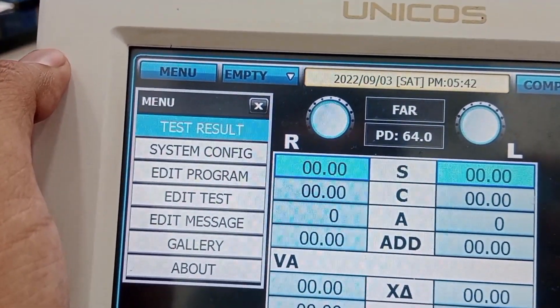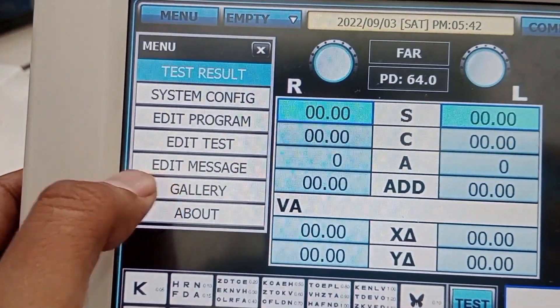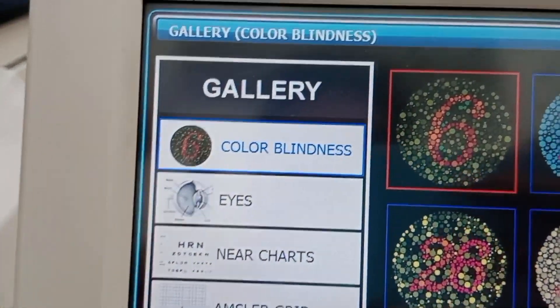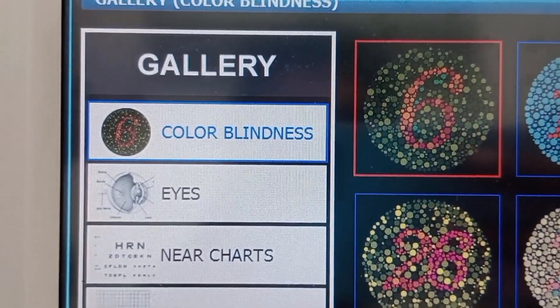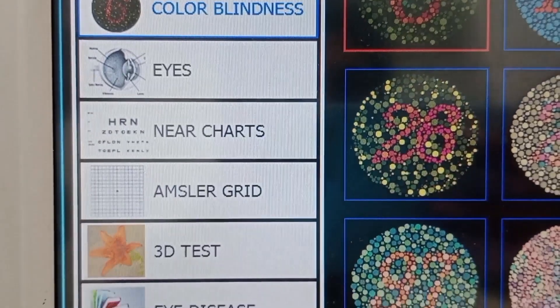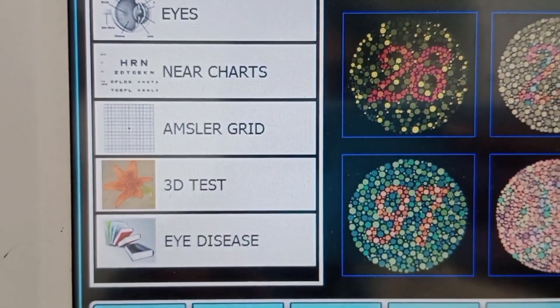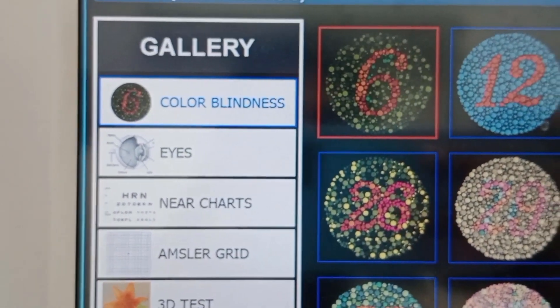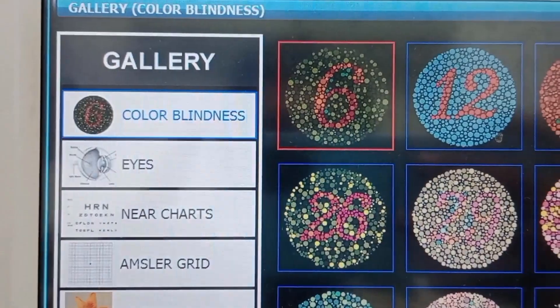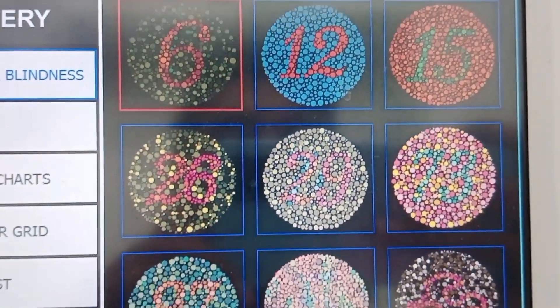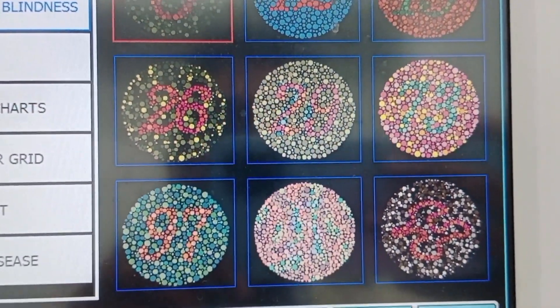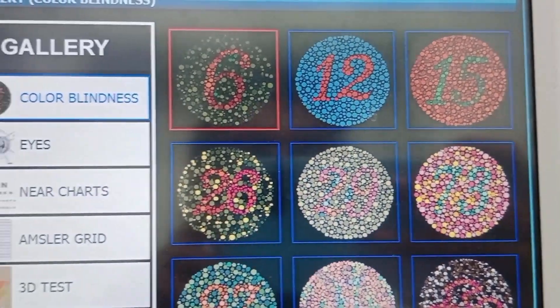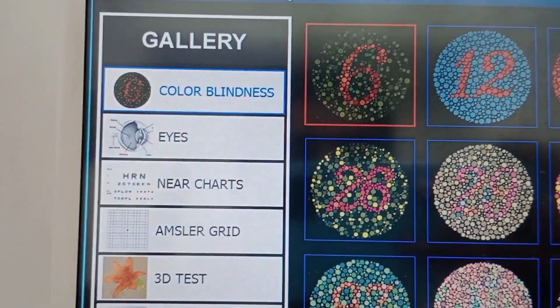The next menu setting is gallery. In the gallery, we have a color blindness test. You can see this is the Ishihara chart, and if I click on it, you can see these images used for color blindness testing.